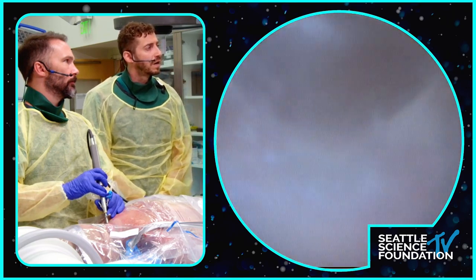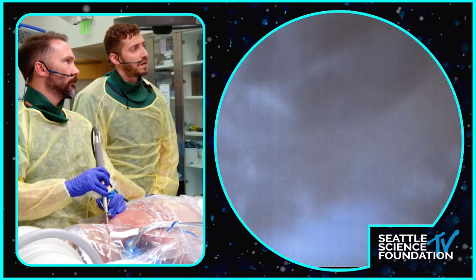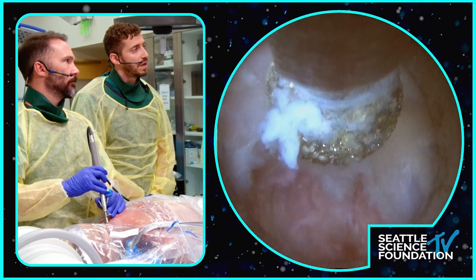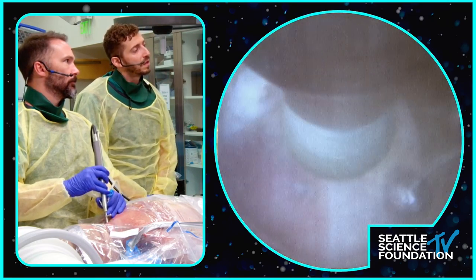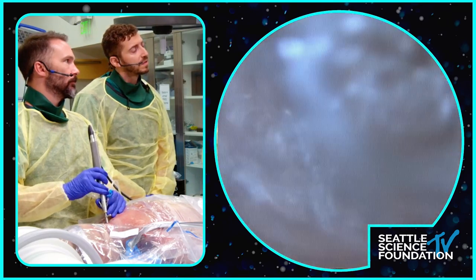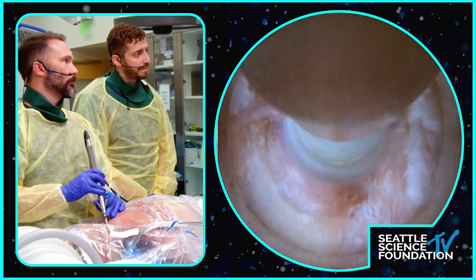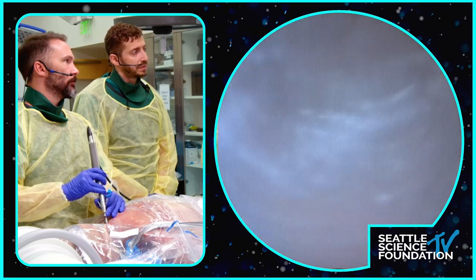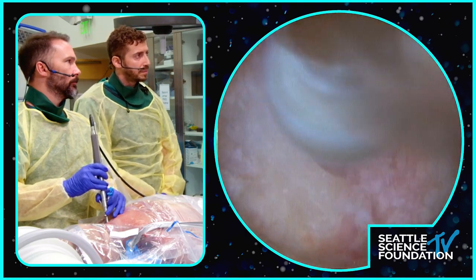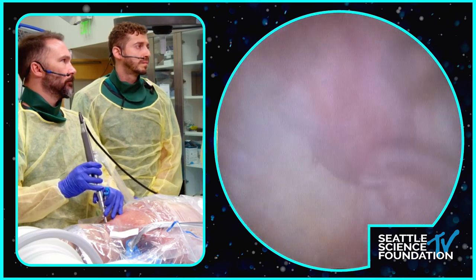Tell us what you're paying attention to right now. The drill is not only to resect bone but also to expose anatomy and better understand it. As you drill, you're exploring and paying close attention to how thick the lamina is. The lamina in the cervical spine is typically not very thick, so if you start drilling very deep holes in bone, you're typically lost in the spinous process — you need to raise your hand a little and go more lateral. Whenever the bone becomes very thick and you're drilling a lot, you're typically in the spinous process.